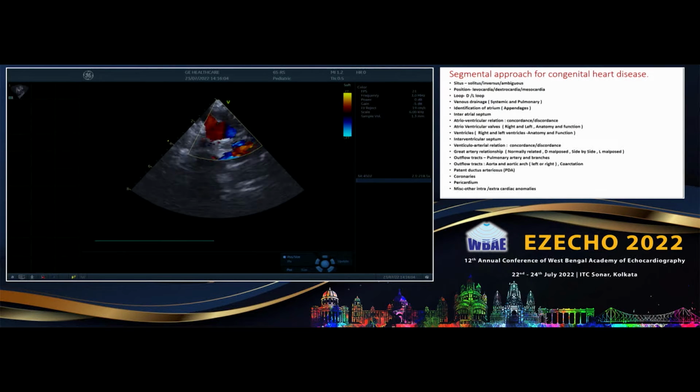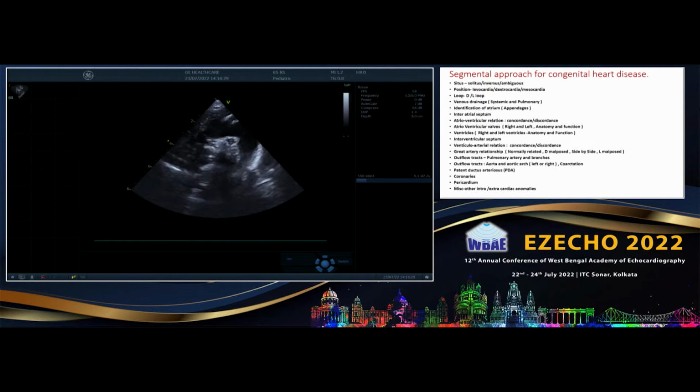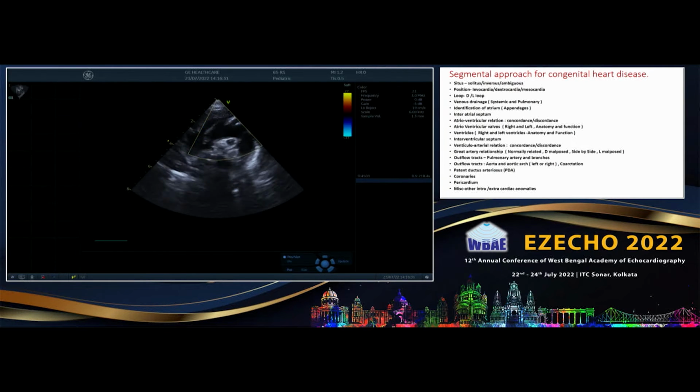And this is the first branch which is going to the right. So if the first branch going to the right is dividing, surely it is the innominate, which is dividing into the right subclavian and right carotid. So it is a left-sided arch. Non-division is seen if there is an aberrant right subclavian artery, which is the fourth branch. It is rare. So then she has just shown.